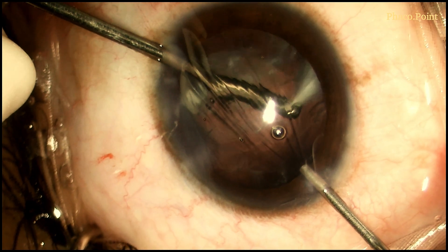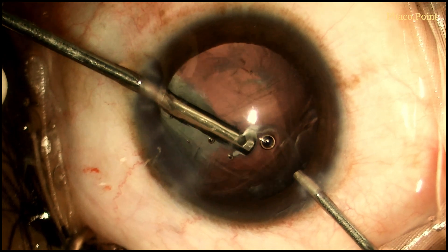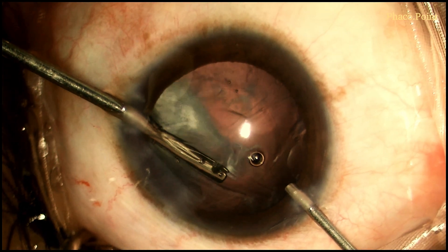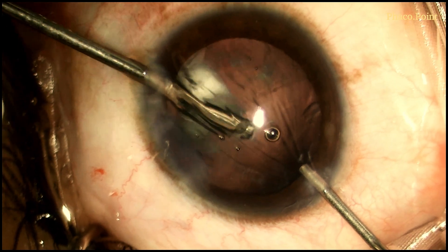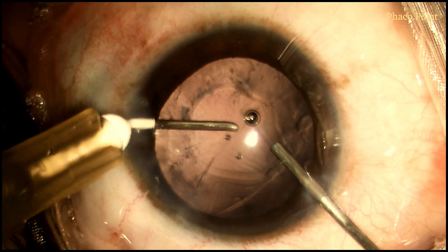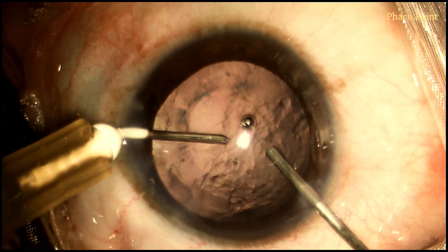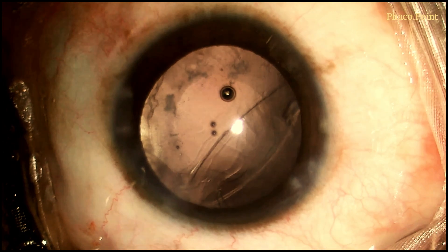How does one decide that the vitrectomy is complete? You will find in this case that the edges of the PCR have moved closer to each other, signifying that the vitreous has been cleared completely from that area. Following the successful completion of the vitrectomy, the vitrectomy probe is now removed from the eye and viscofluid exchange is performed once more prior to removing the irrigation out of the eye.